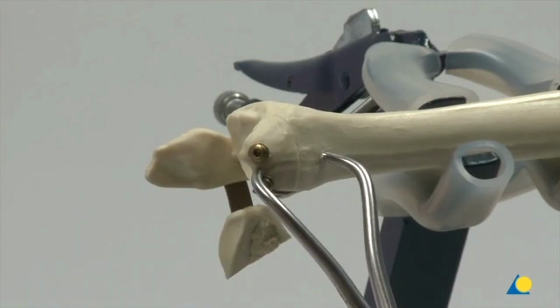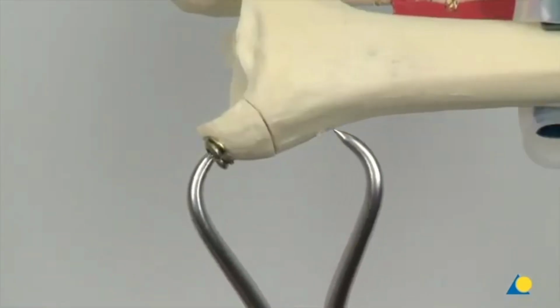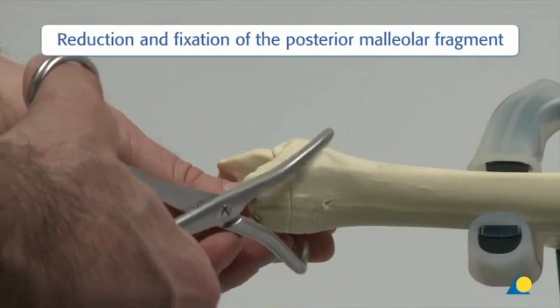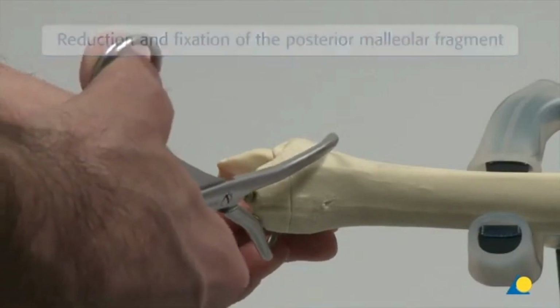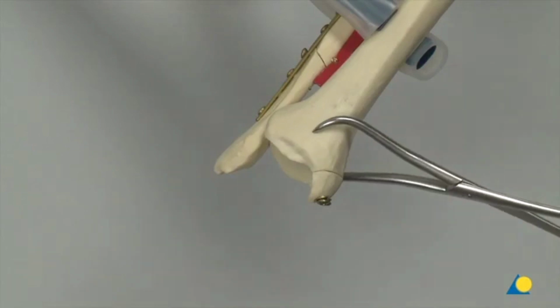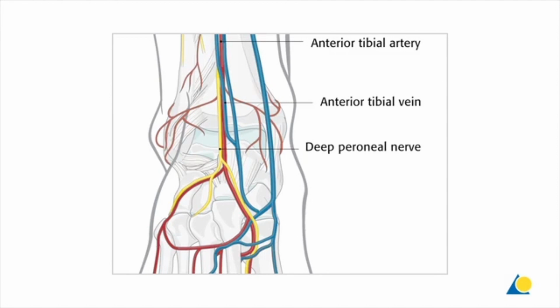The next step is the reduction and screw fixation of the posterior malleolar fragment from anterior. For the purposes of the practical exercise, the reduction of the posterior malleolar fragment is held using the pointed reduction forceps. Clinically, this would not be done. Clinically, it is important to allow visualization of the tibia in order to avoid damaging soft tissue and neurovascular bundles during drilling and screw placement.